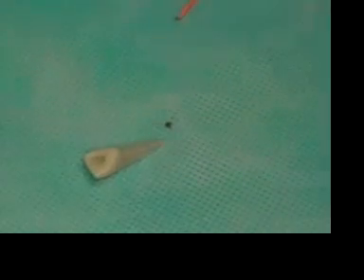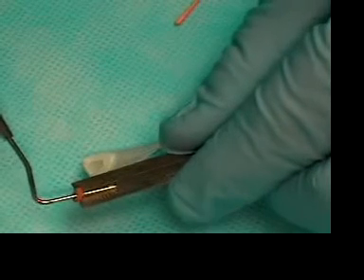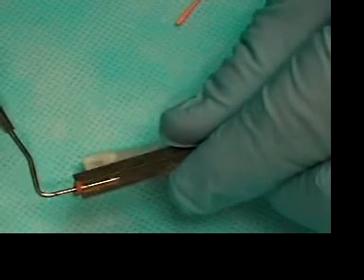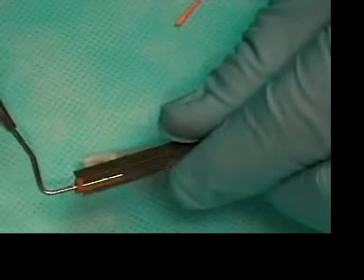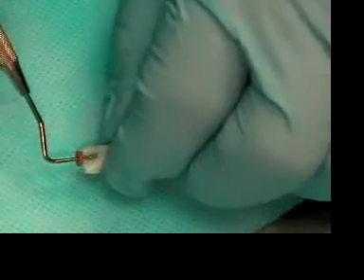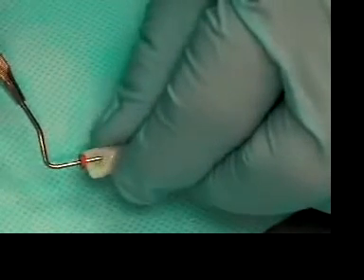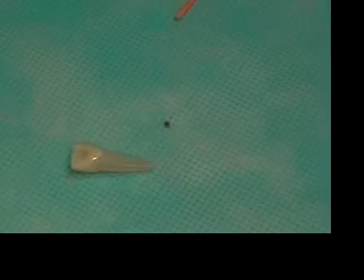So the next plugger that we want to try is the number 10. We measure the 10 at 12 millimeters, put it in the canal, and the 10 goes down to 12 millimeters without binding on the walls of the tooth. So the number 10 plugger will be our first plugger.